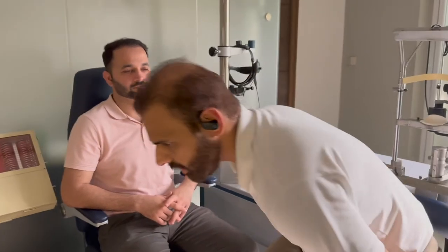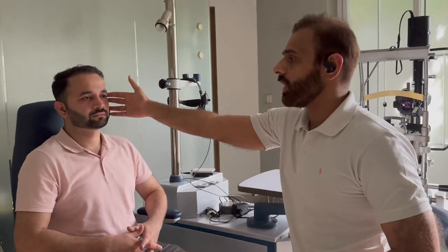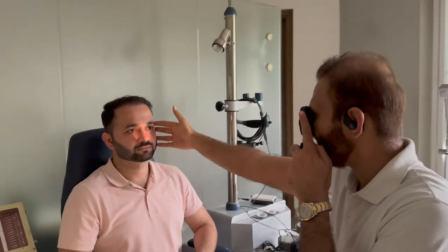After coming to the same eye level as the patient and being at an arm's length away, the first command you give the patient is to look at a distance, so the patient is not accommodating and therefore not causing the pupil to constrict. Then you shine a light in the eye and view through the pupil.